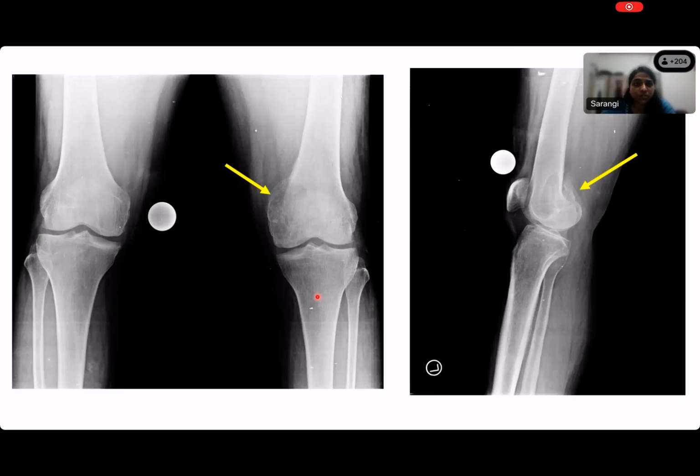All right, so it is in the epiphysis, it has actually reached the condylar surface. And once again, you see that the cartilage, which you should expect, which is lining the lower end of the femur and the upper end of the tibia, because that is the joint space, you should see cartilage, but you're not seeing cartilage. Why? Because this is a plain X-ray, right? So the cartilage is radiolucent, that's what we mean. So it doesn't stop the X-rays from passing, whereas bone does. So you are seeing this, very good.